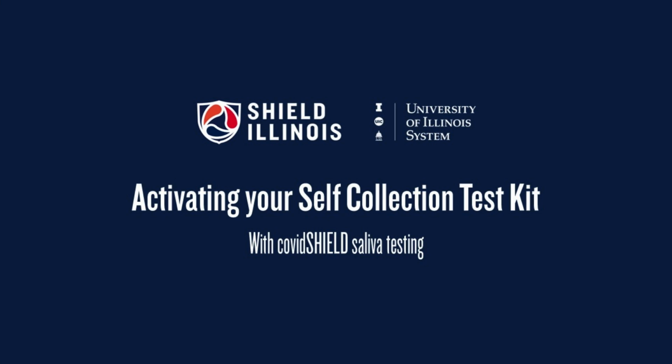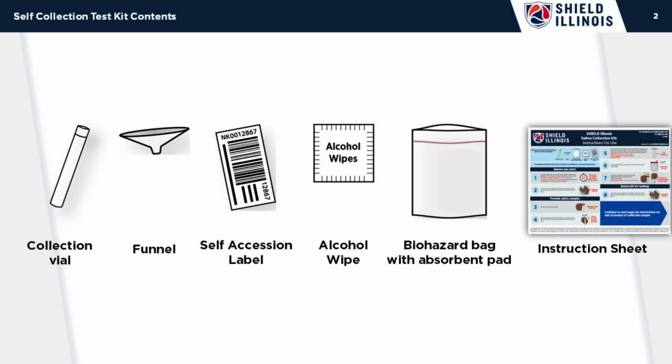Activating your Shield Illinois Self-Collection Test Kit in the Point and Click Patient Portal. Your testing site will provide you with a kit for self-collection which includes a vial, a cap, a funnel, a label, and alcohol wipe, and a specimen bag with an absorbent pad, as well as an instruction sheet for providing a saliva specimen.